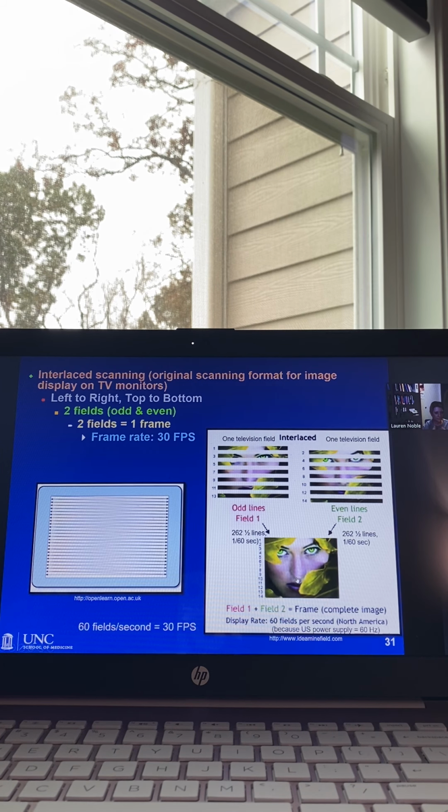So if you have a unit that has a very low MA, what does that mean in terms of the X-rays coming out? Is it continuous? Yes. Okay, it's continuous. The image displays as a full image because of this interlaced pattern. Okay, this interlaced pattern.